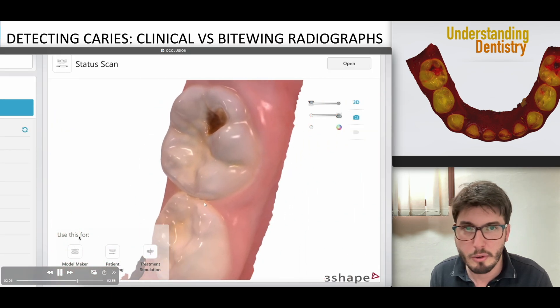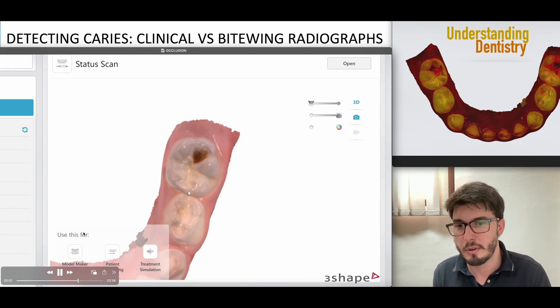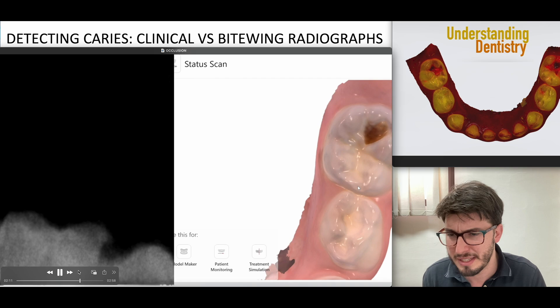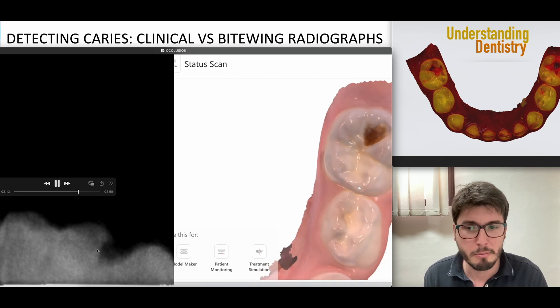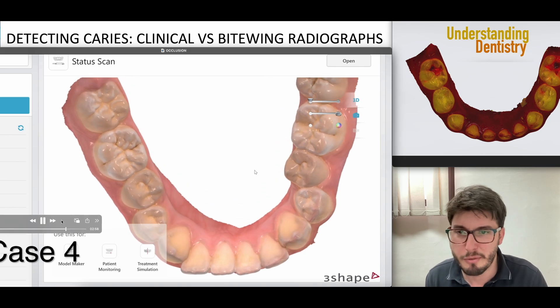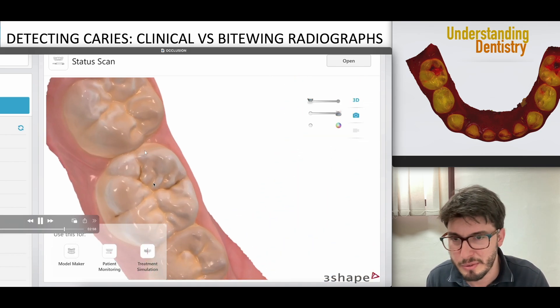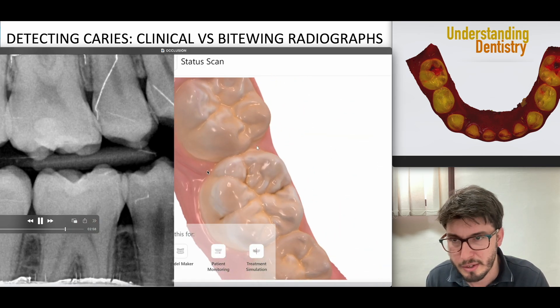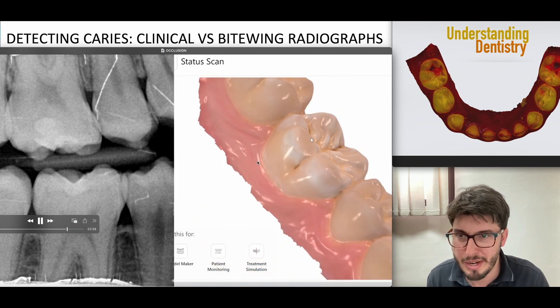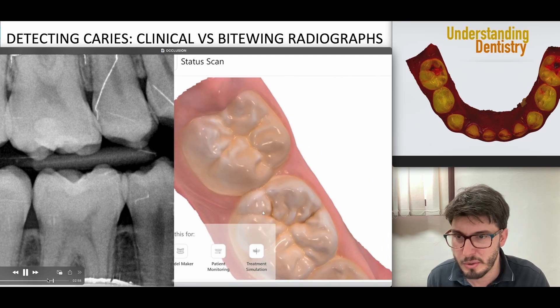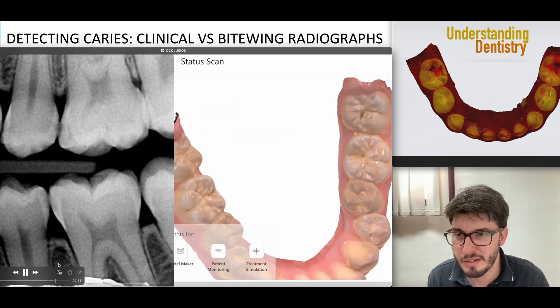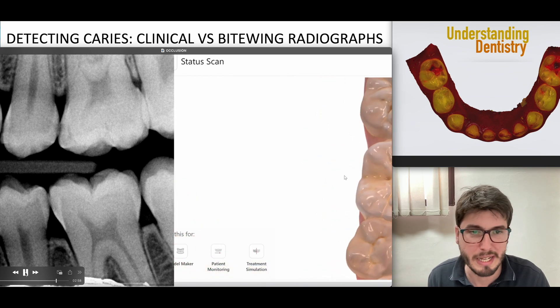On the other side, we can see the cavitation, though this bitewing is not good at all. Case four: you're seeing stained fissures. We need to assess with the radiographs as well. There are some changes on the occlusal surface, but they're not too severe.